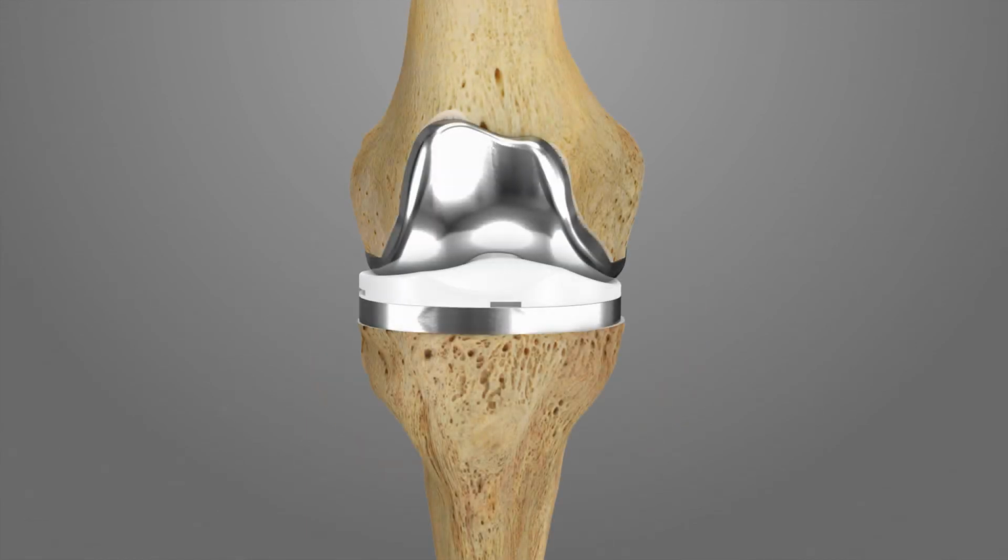After implantation of the iTotal PS knee replacement system is complete, closure is performed according to standard protocol.